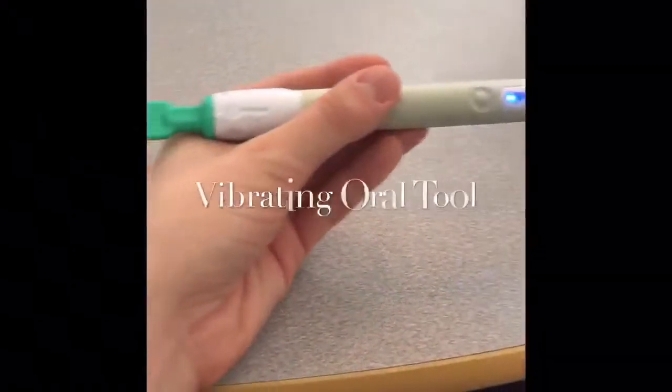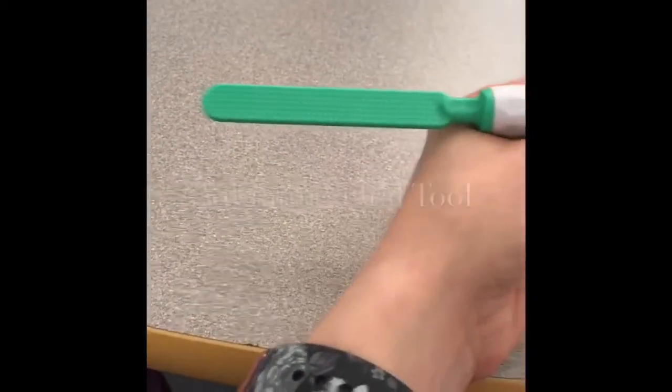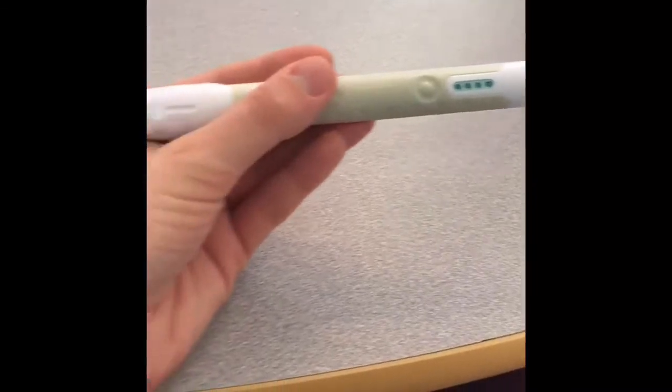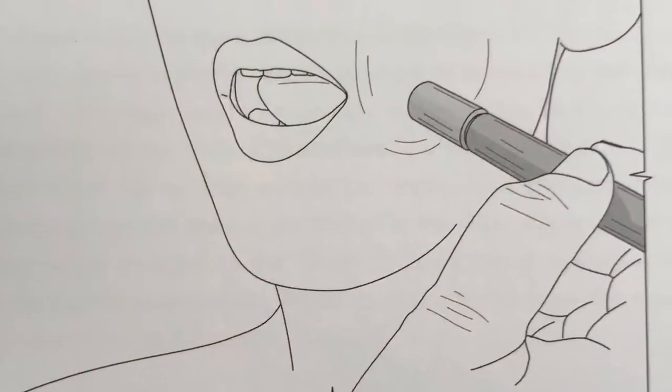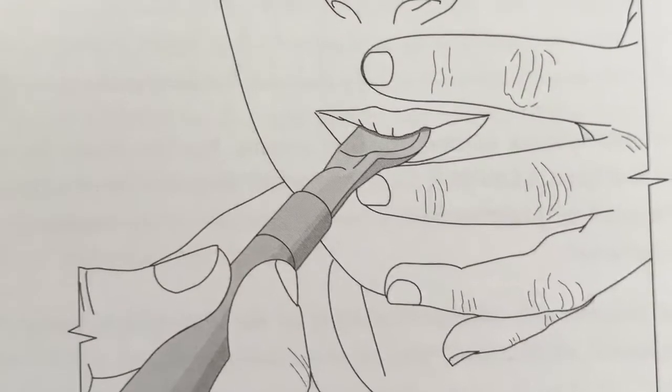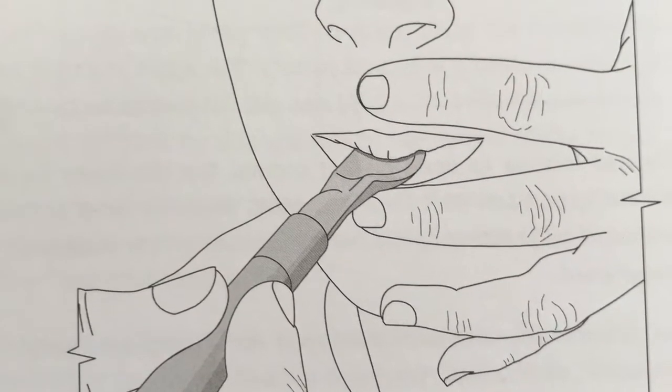This tool can also help develop tongue mobility and lateralization, which is the ability to move the tongue from side to side. This skill is necessary for food manipulation and retrieving food particles in the mouth. Furthermore, this tool can be used to teach children the concept of biting and chewing.